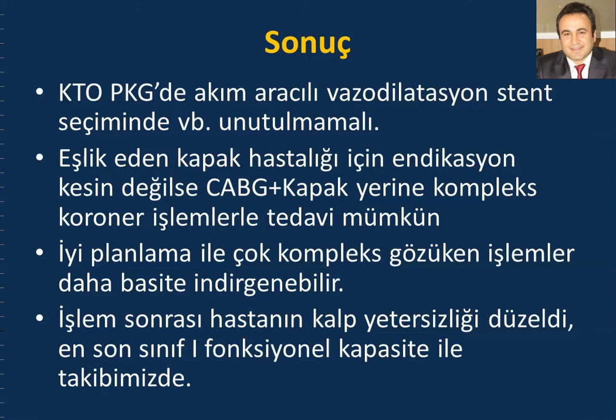We could avoid full stenting of the CTO area or full dilatation of the vessel. We just perform CTO PCI and leave the beyond vessel alone, and it will dilate by the time, as you can see in this patient.